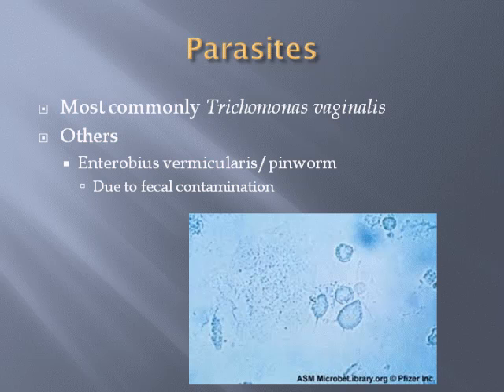Other parasites that are possible to see in urine may be pinworm, Enterobius vermicularis, but that would be really awful collection, terrible contamination, obviously, from the region. But with children, you just never know. It's hard to get urine samples from children, so it's possible you could see pinworm eggs. Mostly, I can't imagine, maybe a live worm here and there, but mostly we're looking for Trichomonas vaginalis.